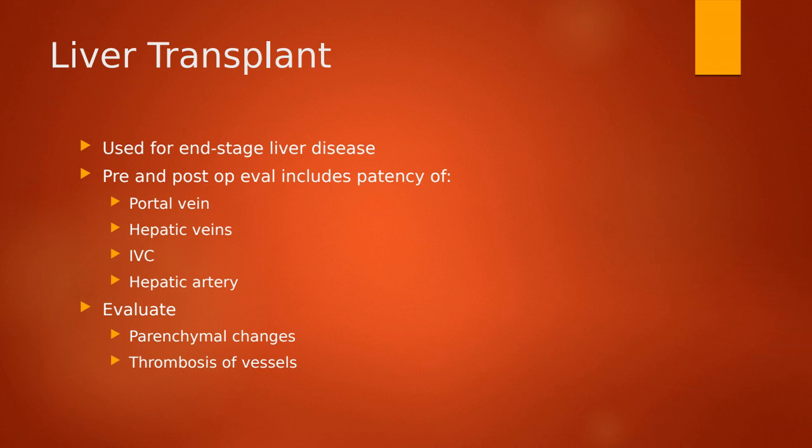So again, this was kind of a recap here, but we did learn some new things about renal artery exams and about mesenteric evaluation. So please make sure, again, you understand that information and that you are refreshing your portal, hepatic, and your liver anatomy and your vascularity, all of that stuff, because that is something that we are performing quite a bit of. So any questions you can ask.